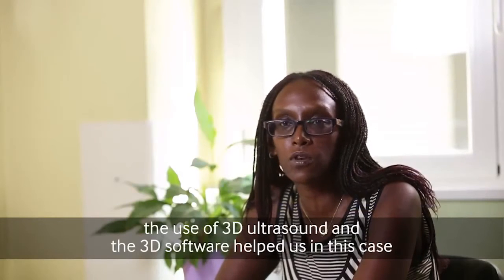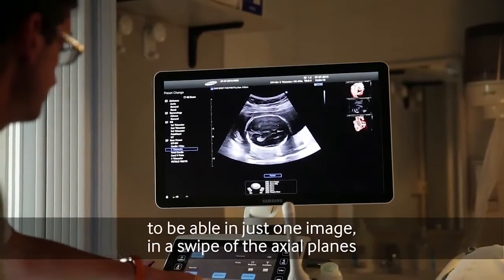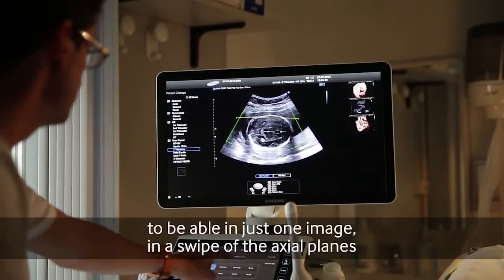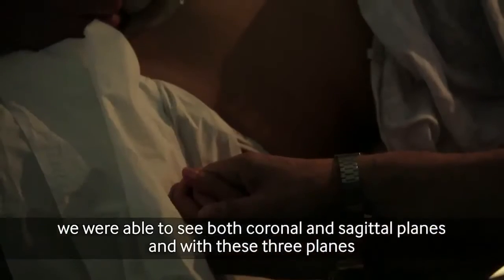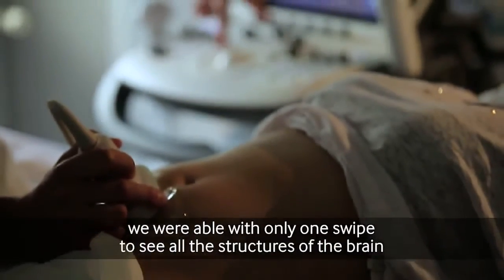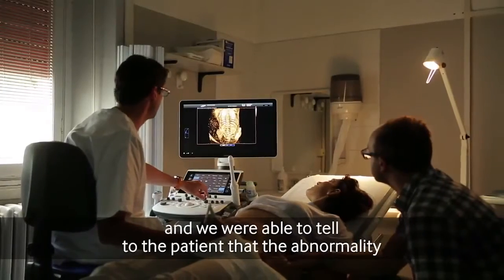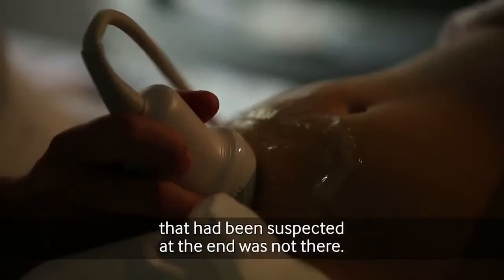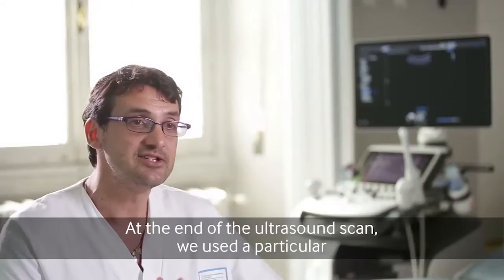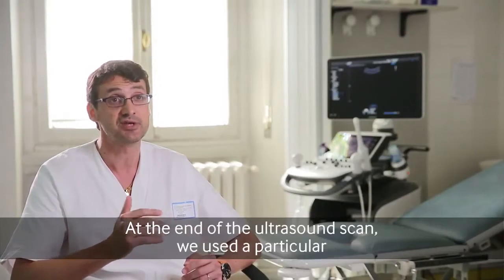The use of the 3D ultrasound software helped us in this case, in just one image, in a sweep of the axial plane, to see both the coronal and the sagittal planes. In these three planes, in just one sweep, we are able to see all the structures of the brain, and we were able to tell the patient that the abnormality that had been suspected was not there.